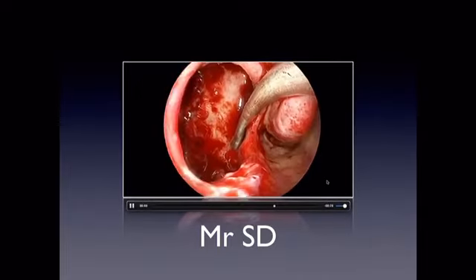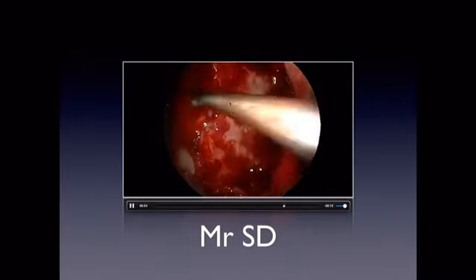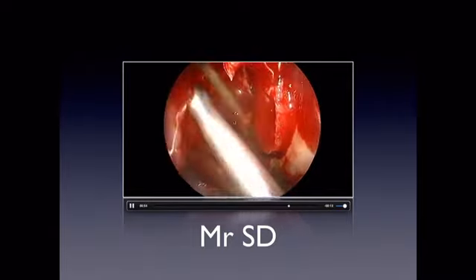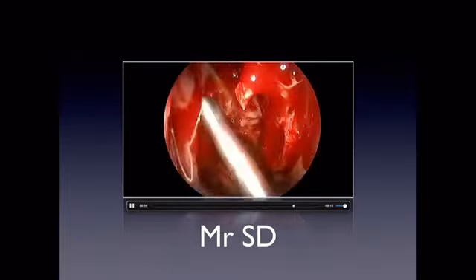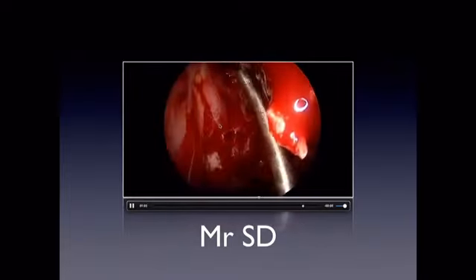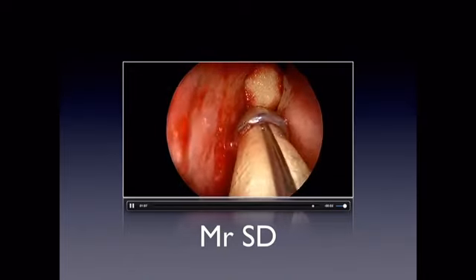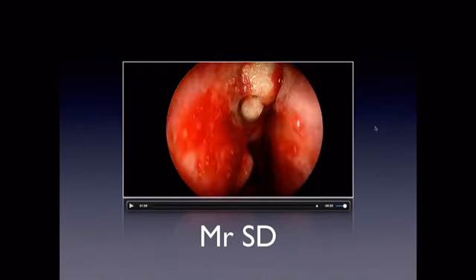So what I've done here is clear basically all the mucosal sites. Now I'm not looking to clear out that blood or anything there. It might bother you guys seeing a bit of blood, but from our point of view, it's really trying to see if there's any residual disease that might be the base of that polyp. It was quite difficult surgery, went quite nicely, but it was a bit bleeding, so we're filling that now with some hemostatic material called Surgiflo to try and reduce any post-operative bleeding.